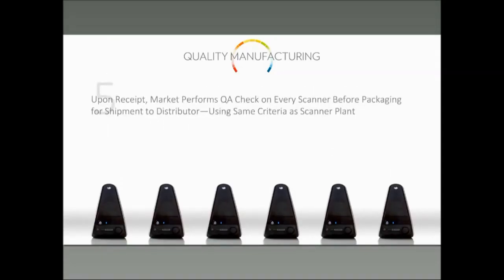All right, your market also performs quality assurance checks before they go out to you. So the same criteria as the scanner plant is being repeated in the European market to make sure that the scanners are working correctly. And scanners that fail before they even get to you are sent to the scanner plant for rework.